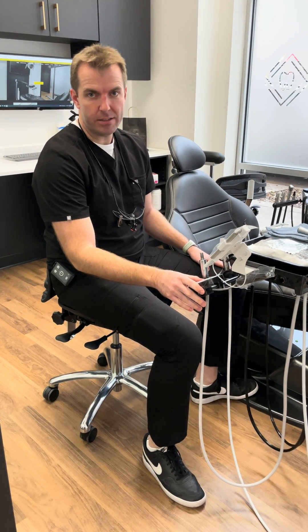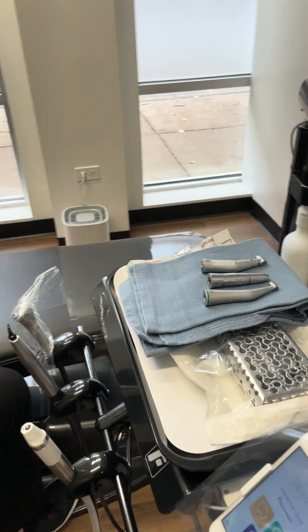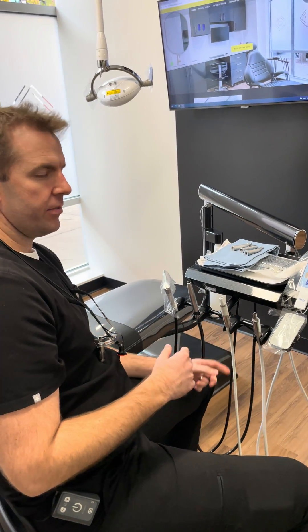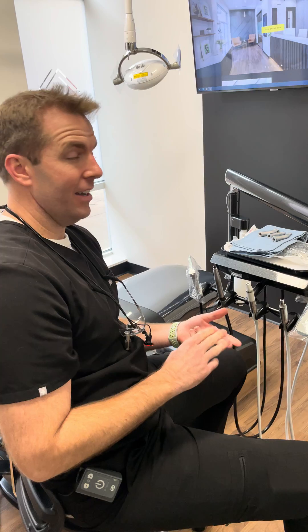It's been working out really great. I'm going to show you around here. The system — the reason I got it is because it can do kind of everything I might need in one system, so I don't have to have multiple handpieces for my slow speed, high speed, or endo.